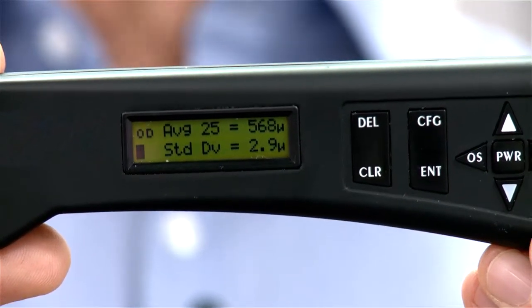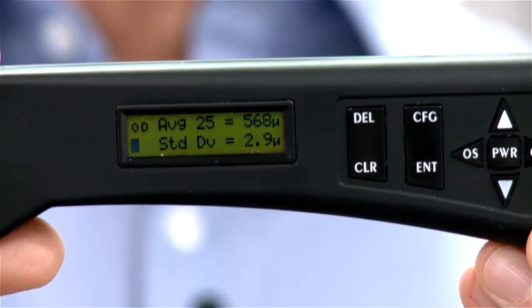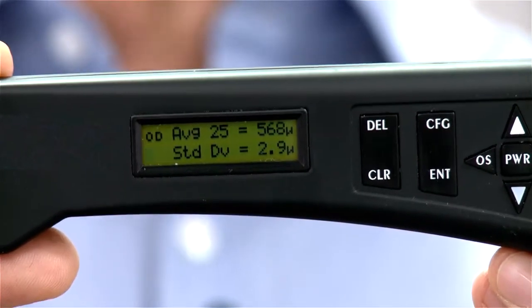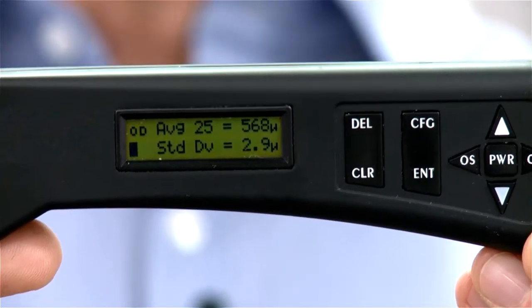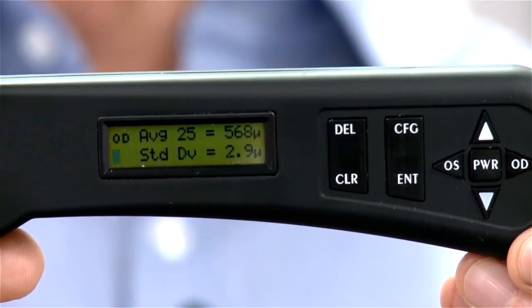The reading is 568 microns, which is a nice healthy cornea. The standard deviation is 2.9, which is a nice low figure. That was indicated by the nice close proximity of the beeps, which means it was an accurate reading. If the beeps had been wider apart or less stable, you'd have a much wider standard deviation, and you might need to repeat the measurement to improve accuracy.